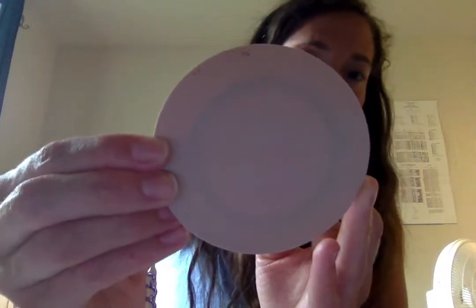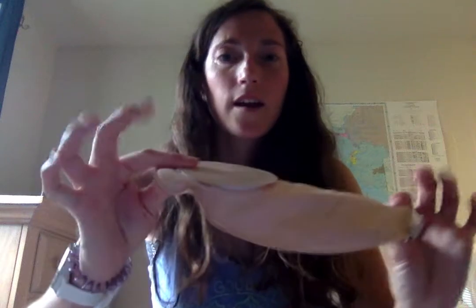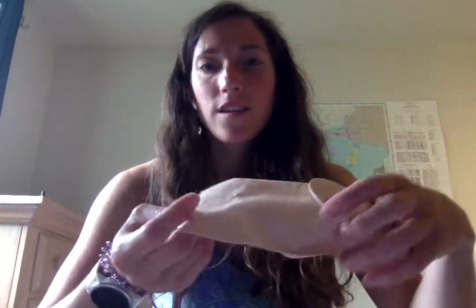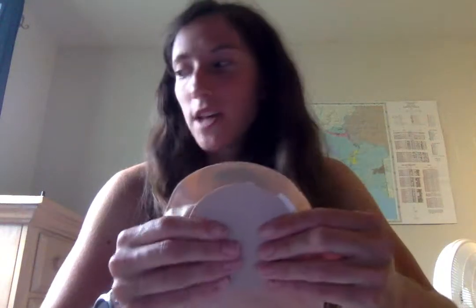and then I ordered these Osto Solutions caps, and they can connect right to the bag and then kind of clip on there and seal off this bag so it's its own closed container catch system. And then I'll end up throwing this in a garbage bag or something else that I'm carrying. This tends to create a lot more waste because then I have to carry a lot more extra bags and these caps. So again, depending on weight or where I'm headed, I may or may not use this system. It's just one that I tried a couple of times.